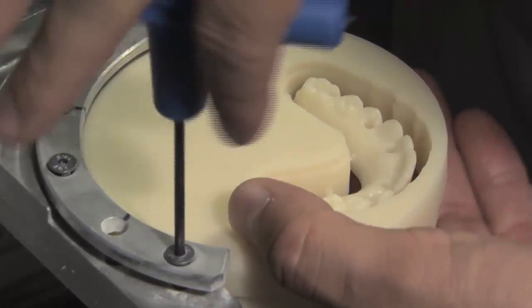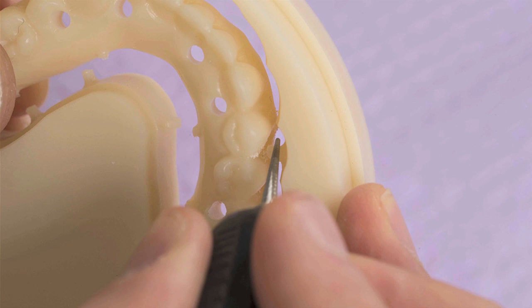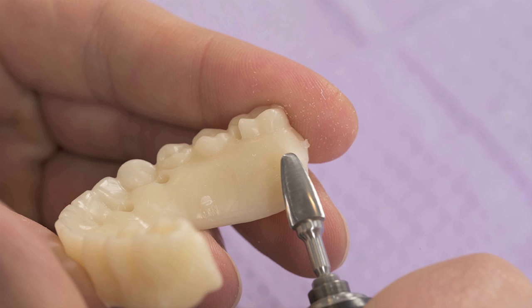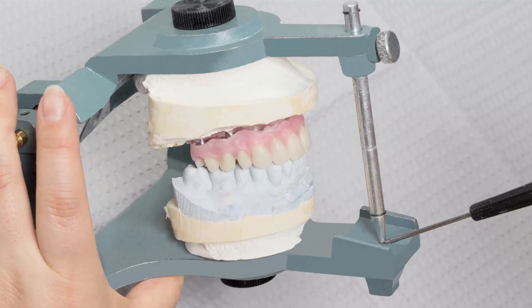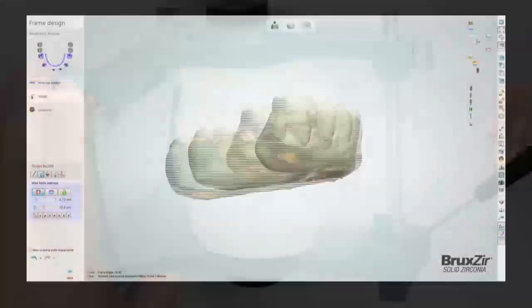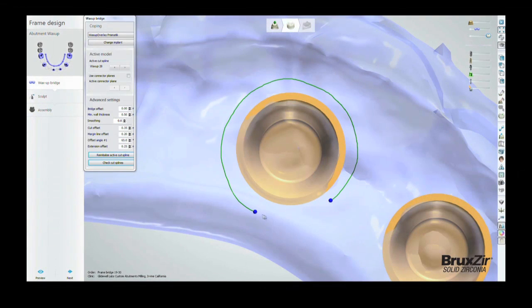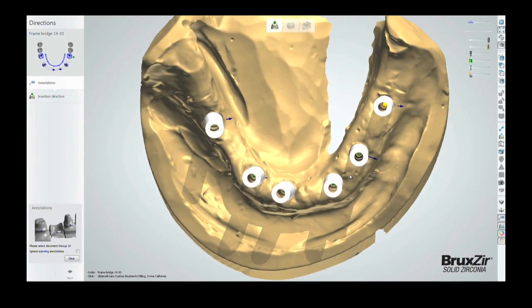Following milling, the provisional prosthesis is removed from the PMMA block. A handpiece is used to first remove the sprues from the provisional prosthesis and then touch up the incisal edges and gingival areas in order to achieve desired aesthetics. It is then mounted onto the articulated MasterCast to verify proper fit and occlusion. Due to the CAD-CAM design process, the alignment of the inserts along with the fit and bite of the provisional do not typically require adjustment.